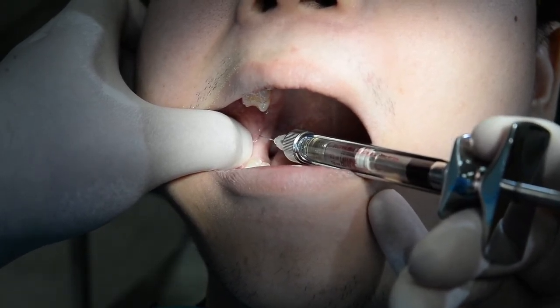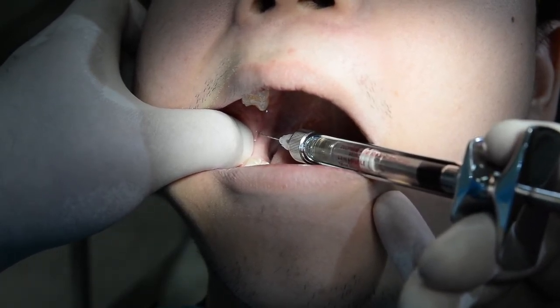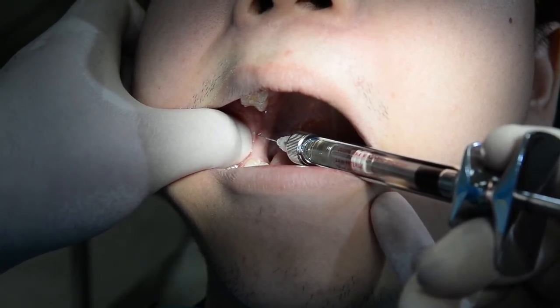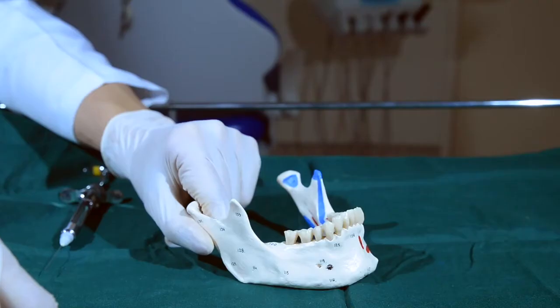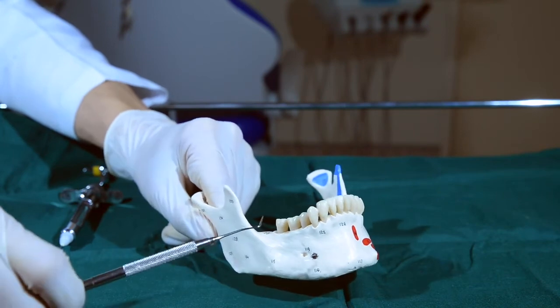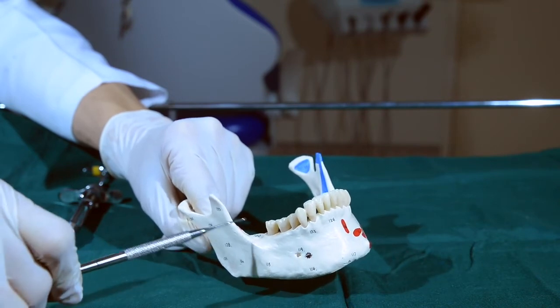Once half the cartridge is given, withdraw the needle slowly while continuously depositing about a quarter of LA to anesthetize the lingual nerve. Once complete, withdraw the needle fully. The long buccal nerve block injection site can be located distal and buccal to the last molar, to anesthetize the buccal soft tissue adjacent to the mandibular last molar.